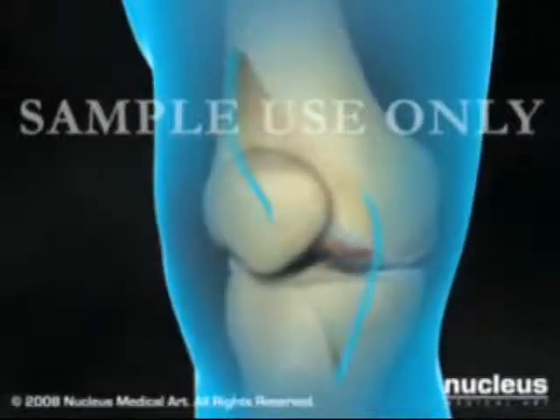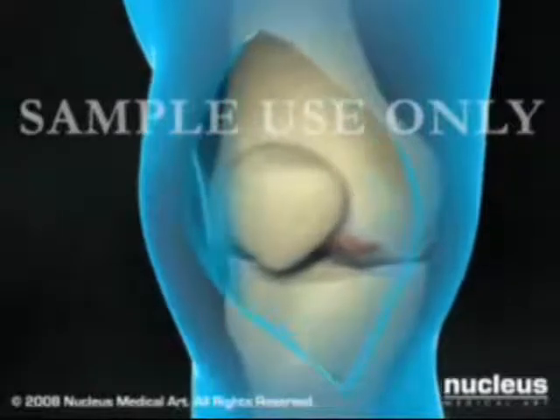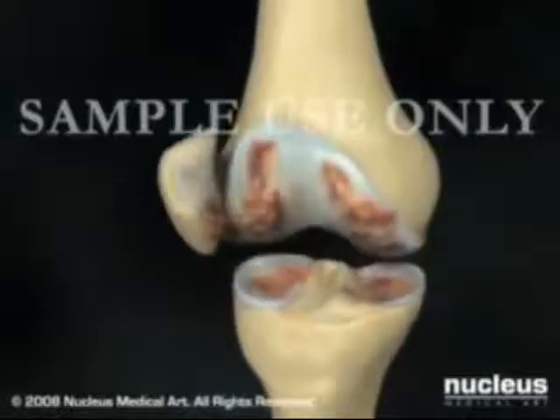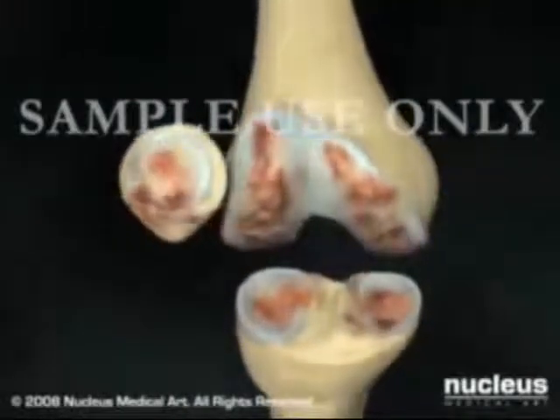Your surgeon will make an incision along the front edge of your knee. After separating the muscles and ligaments around your knee, your surgeon will incise the knee capsule to gain access to the inside of the joint.